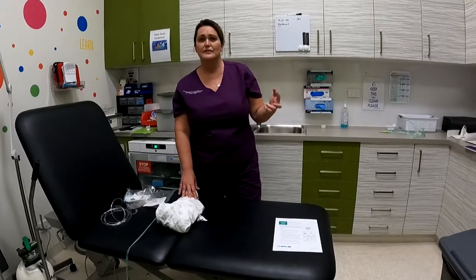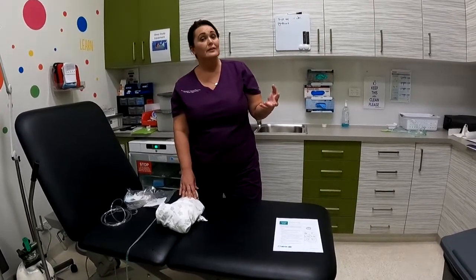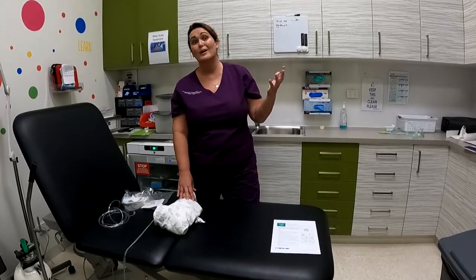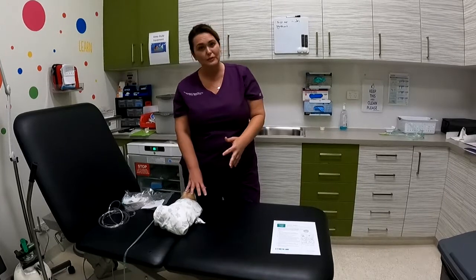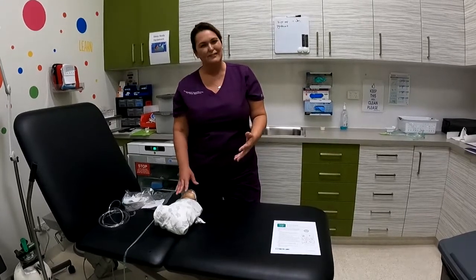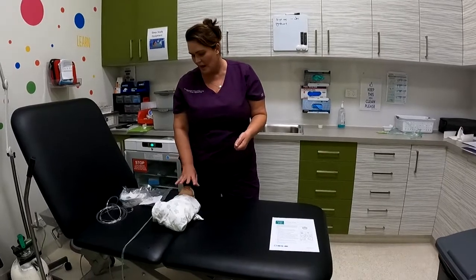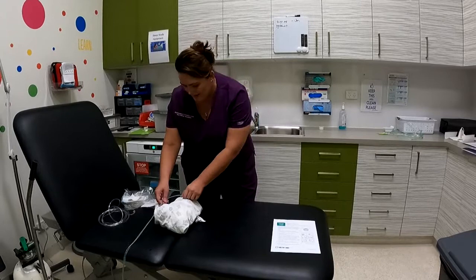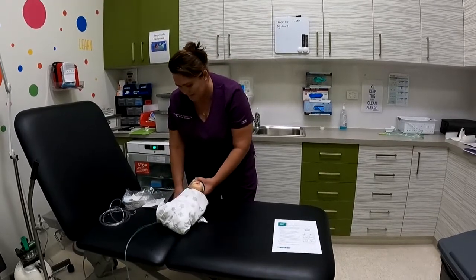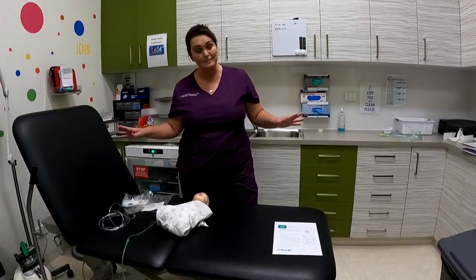As I said, there's lots of different tapes on the market. There's lots of Facebook groups as well that you can jump on and have a look and see what other people all over the world are using to tape their oxygen. These are just two ways that lots of our families use. So that's what I've demonstrated today. So as I said, every 7 days you change the prongs and the tapes all at once. Throw your old prongs out and you're all done.